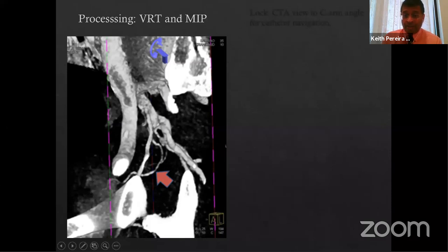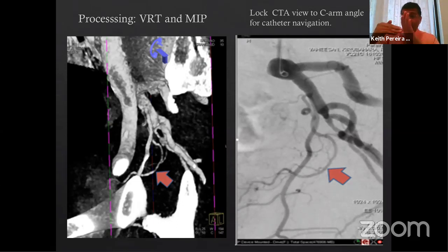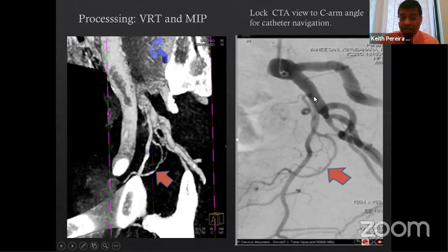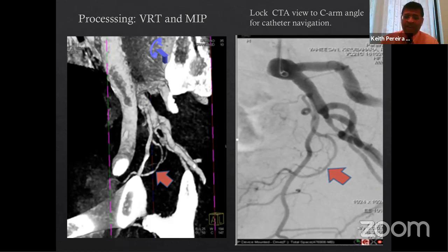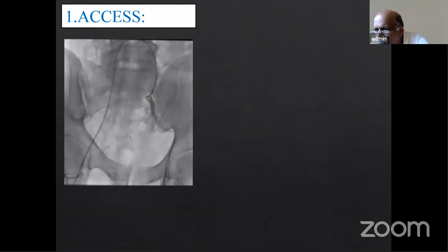We lock the CTA with the C-arm angle — based on the angle from the CTA, we know the exact angle needed to see the origin of the prostatic artery during fluoroscopy. I learned this from Dr. Pisco's group in Portugal; they do this for every case, even after 1,700 cases — same routine. It's important to follow this protocol consistently to be successful. For access, I'll cover a few steps: I'm a big radial advocate for many procedures.